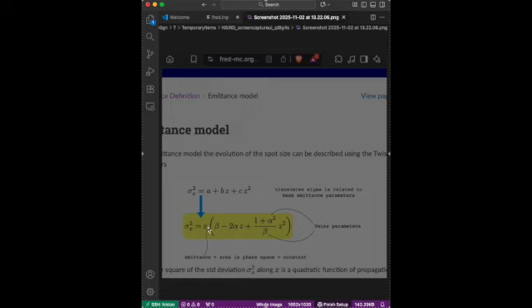So when you put emittance equal to zero, you make the divergence and the deviation equal to zero. That means the pencil beam has zero spot size. Hypothetically, it's exactly what a pencil beam should be, with no spot size.